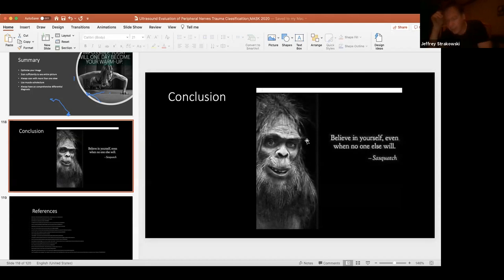It's prognostication with ultrasound. Say, for example, if I'm dealing with some fascial thickening, I come back to the same fascia because I'm always intrigued by this. I'm trying to release it with whatever possible interventions I can do. And I go back again about 2 months later, and I see the same fascia. It's thicker, less dense. So I'm trying to prognosticate through the ultrasound. Is that a fair thing to do or a stupid thing?